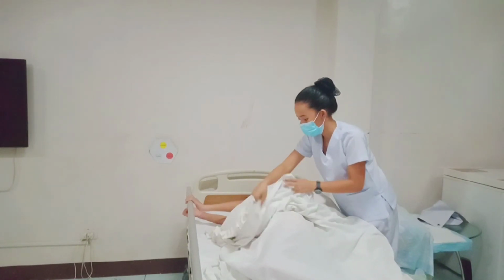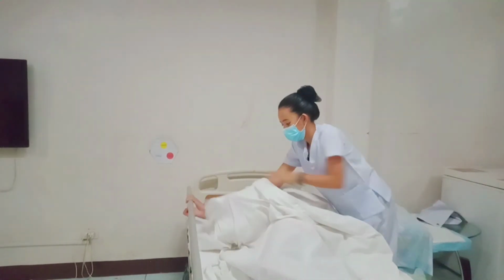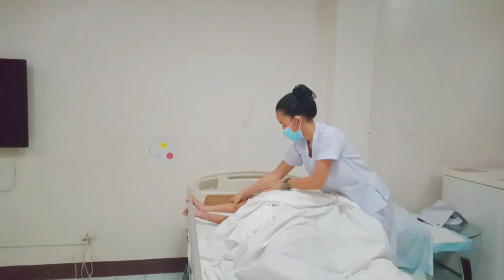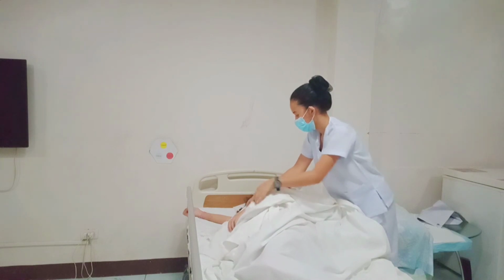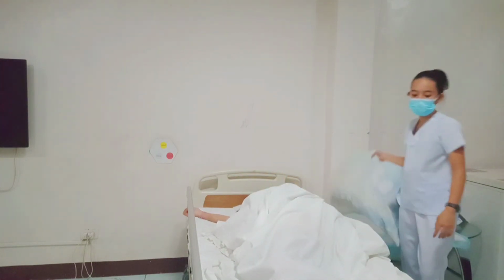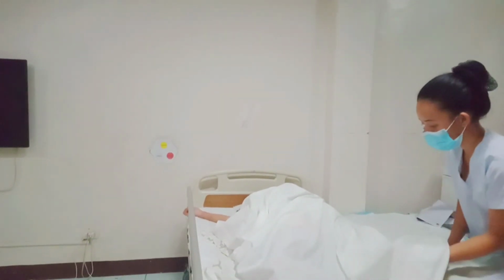Pillow for her arms. Hold one of our arms. And then, lastly, for her legs and thighs.